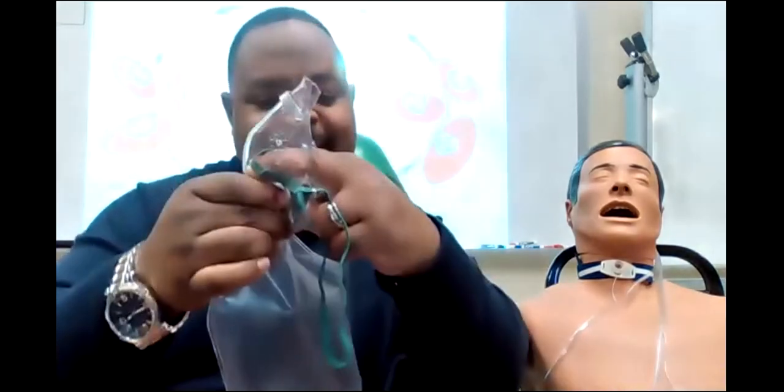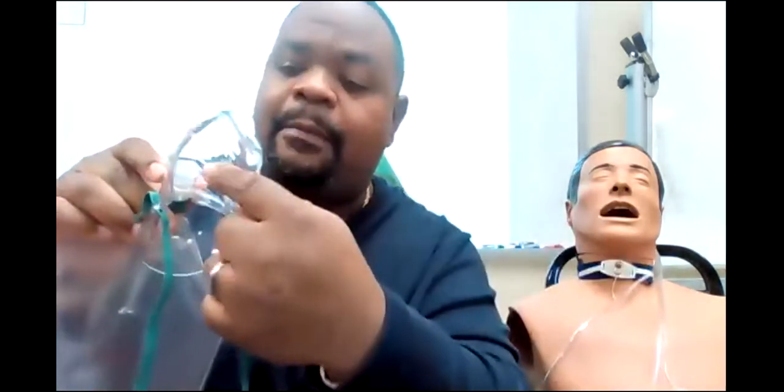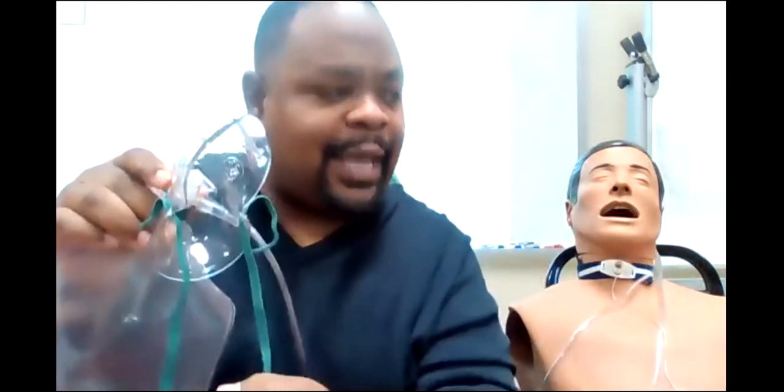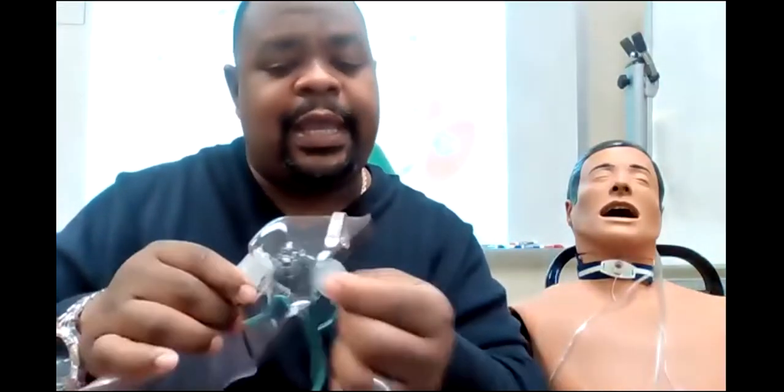It has a mask and a bag reservoir, right? There is no valve between the mask and the bag. Now, when I say valve, I'm talking about a little valve like this, a little rubber valve that you're going to find on the non-rebreather mask, okay? And it will be here and on the sides, okay? And I'm going to show you that next.